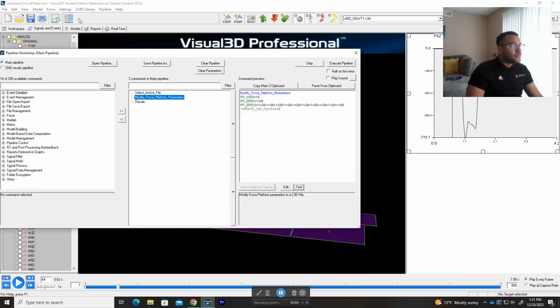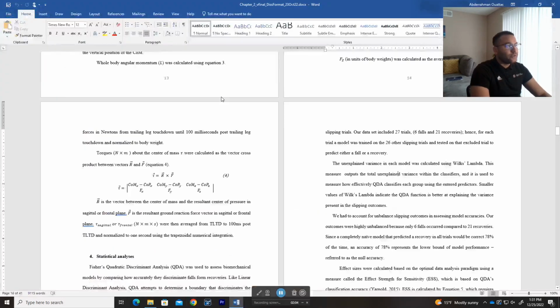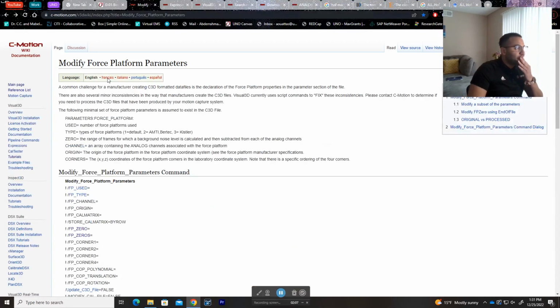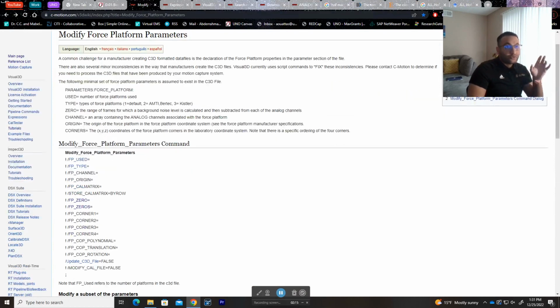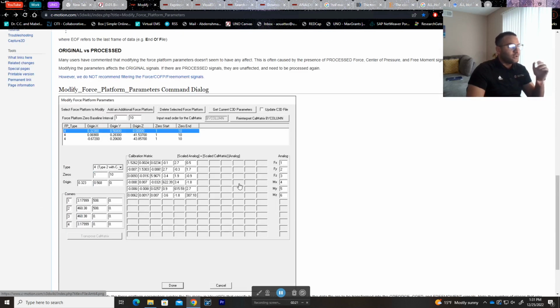So what we'll use for this pipeline is the pipeline command called modify force platform parameters. It basically allows you to modify any parameter you want in the force plate. Make sure you check this C-Motion page, which gives you more information on how, for example, if you want to add a specific force plate to your lab, or if you want to modify that platform later on. And I'm talking about this post-processing.